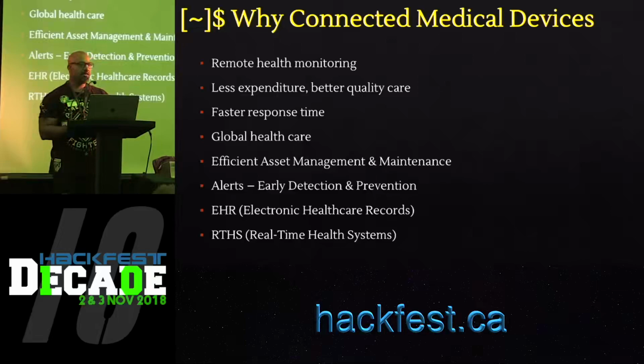So the Department of Homeland Security in 2015 issued an alert against one of the most commonly used serial to Ethernet converters, which is NPort, developed by a company called Moxa. And so there were a bunch of vulnerabilities that were discovered and reported in NPort. One was that it would allow an attacker to extract sensitive information from these devices remotely and unauthenticated. The other one would allow an attacker to upgrade or downgrade a firmware on one of these devices, also remotely, also unauthenticated. And as if that was not enough, there was also a buffer overflow vulnerability that would allow an attacker to execute code remotely without any authentication. So generally a bad idea.